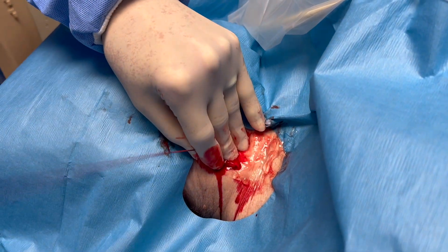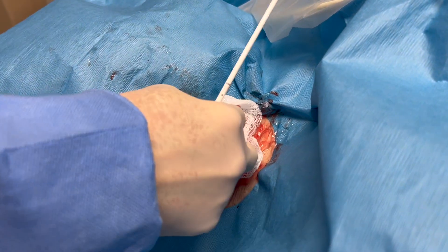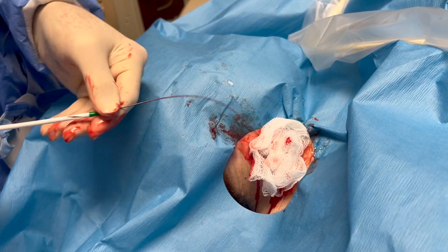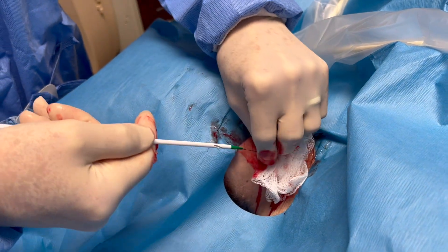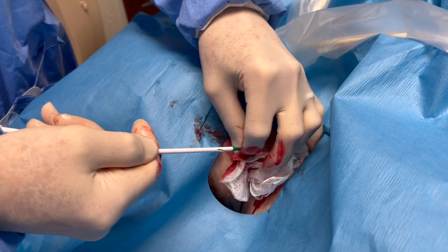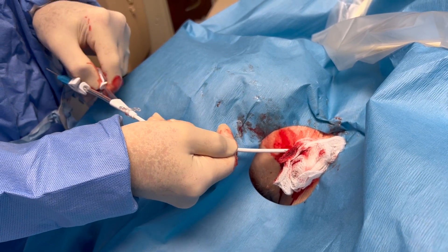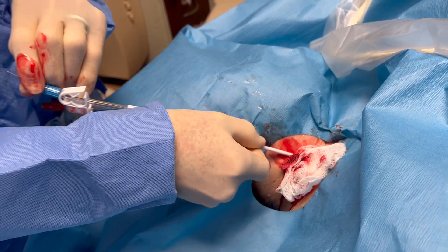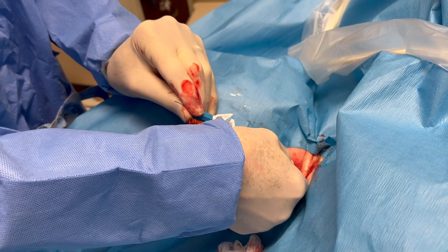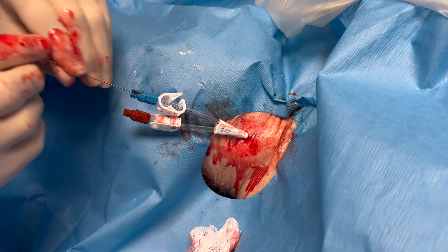Once you dilate it, you will see quite a bit of blood coming out of these vessels, particularly if the patient is fluid overloaded. The dialysis catheter itself is going to have at least two ports. The wire will come out of one of the ports and the other will just be a blank port, but blood will come out of that. So feed the wire up through the dialysis catheter again until you can grip the end of it. Whichever port the wire did not come out of, clamp that one so that the blood doesn't come out while you thread the catheter in. A little bit of pressure may be needed, but you are always clamping the wire in your fingers before you do it.